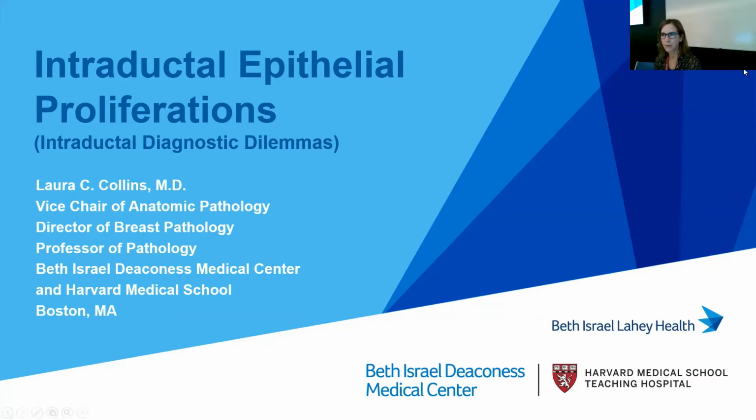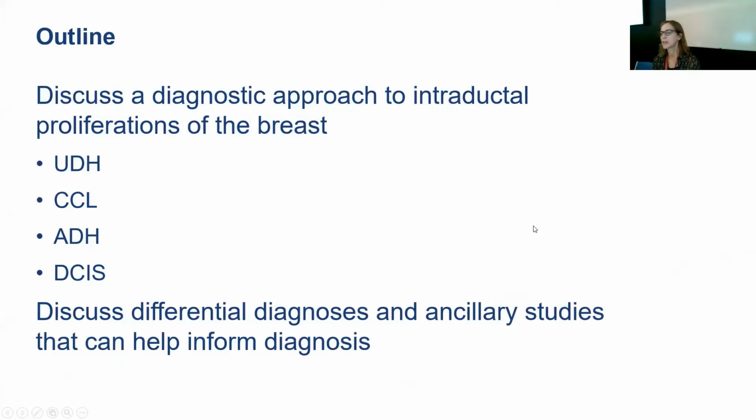To begin with, the first presentation is on intraductal epithelial proliferations, and really trying to discuss a diagnostic approach to these entities with a focus on the differential diagnoses and ancillary studies that can help inform diagnosis.